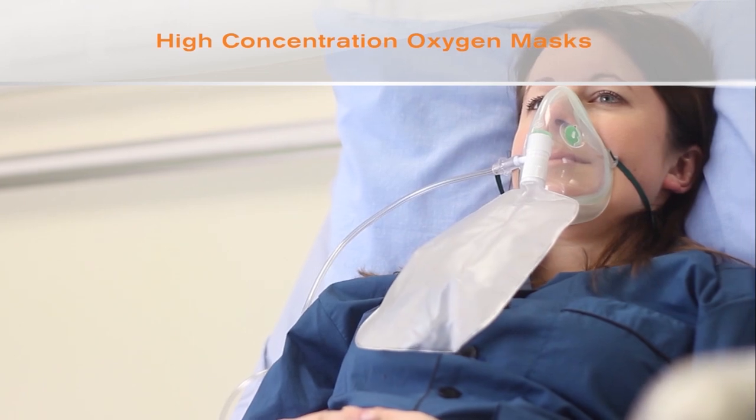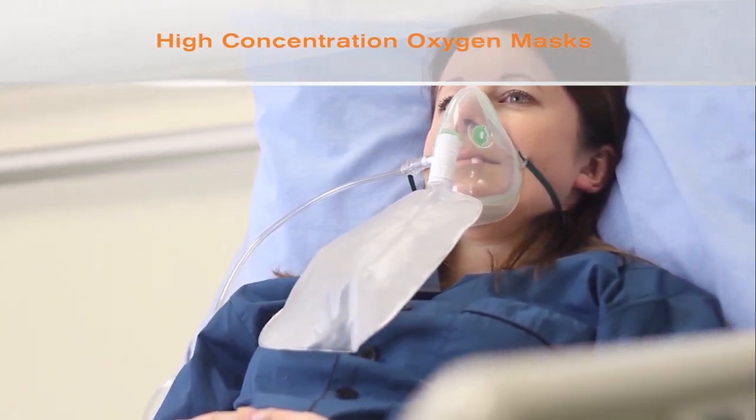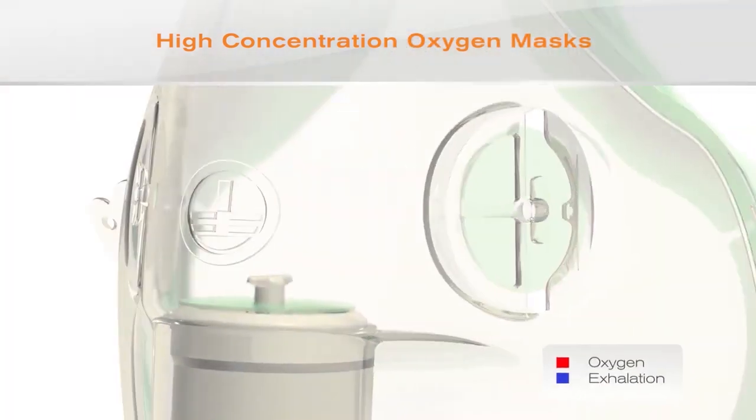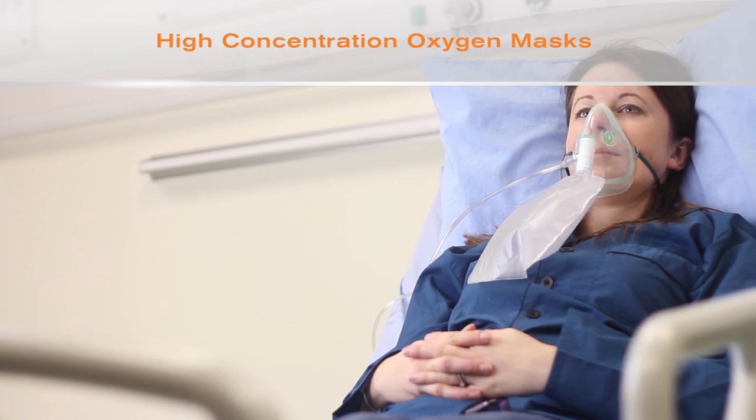The final variable concentration oxygen mask we are looking at is the high concentration mask, also known as the non-rebreathing mask, and is usually used when high concentrations of oxygen are required, for example with a critically ill or unstable patient. The patient breathes from the mask and the inspiratory valve opens so that oxygen is taken from the reservoir bag. The patient breathes out through the expiratory valve.